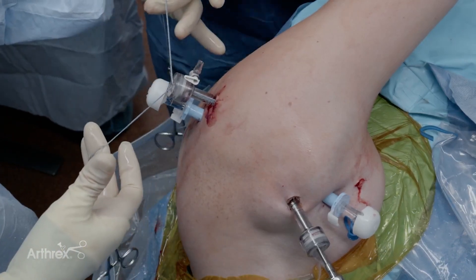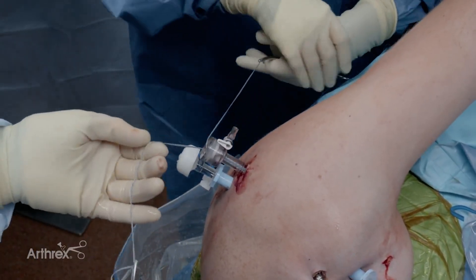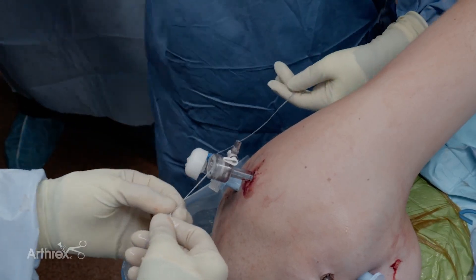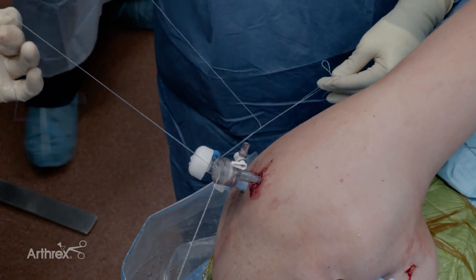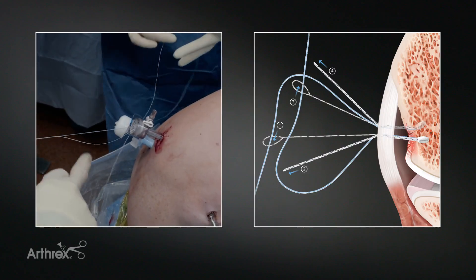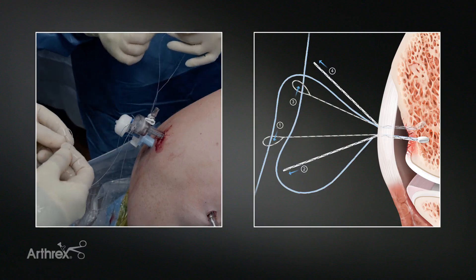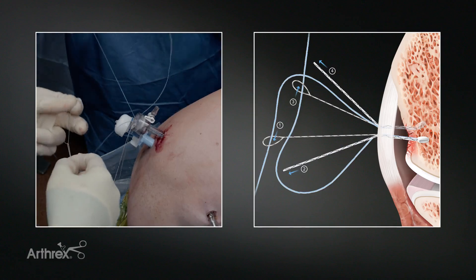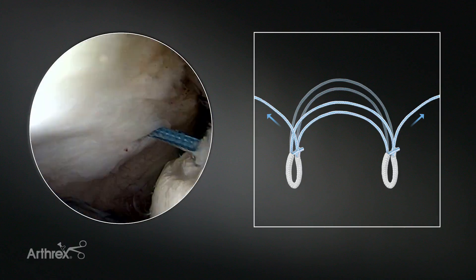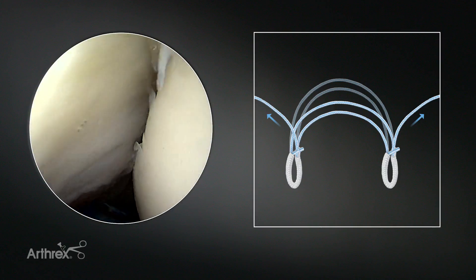Now we have both sets of suture limbs out our posterior cannula. The inferior anchor is here; the superior anchor is the one that I've tagged by doubling up. My assistant and I will take our repair sutures and pass these to each other, then convert so that the inferior repair limb will be going into the superior anchor and the superior repair limb will be going into the inferior anchor, in order to create a double mattress knotless configuration.